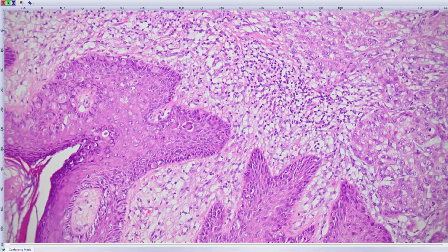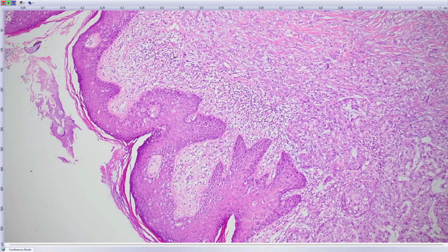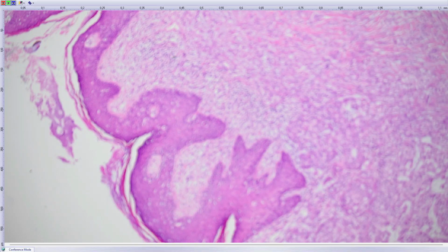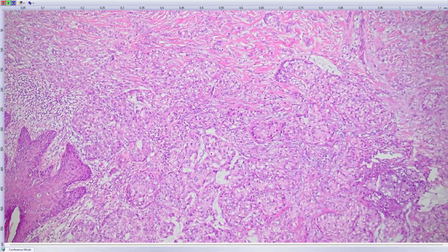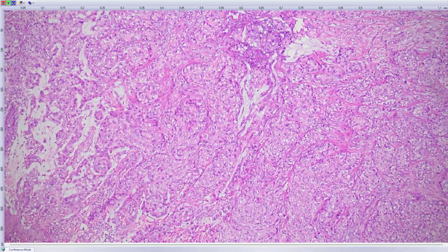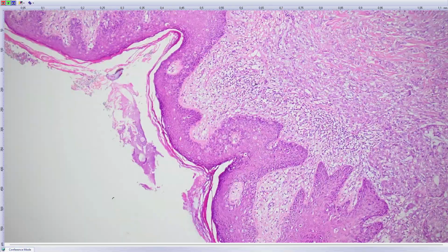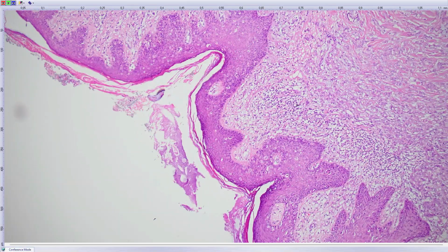It will be ectopic mamma, probably. Yeah, but I didn't see ectopic, but it may be overgrown by the tumor. Okay. That's another possible explanation. So it was sent with the diagnosis: is this a strange skin adnexal carcinoma with Paget spreading? But I think it's not. It's mammary type carcinoma.